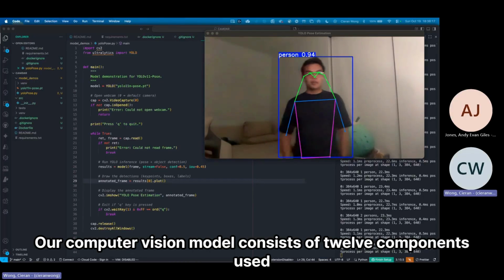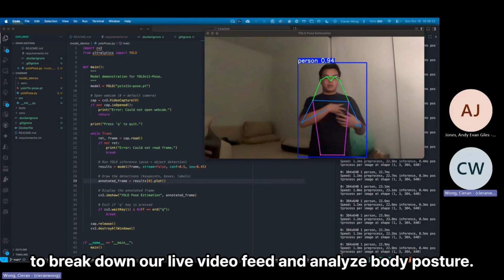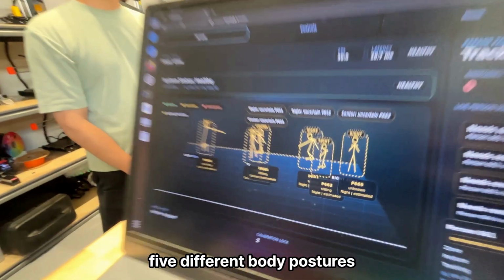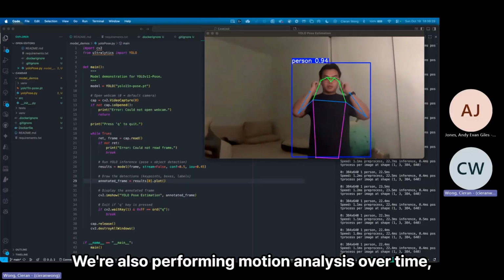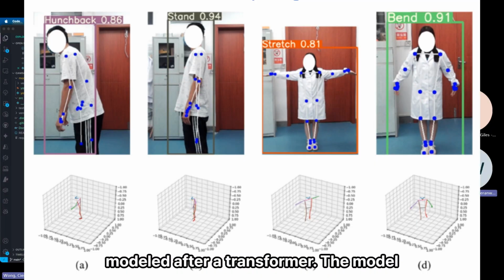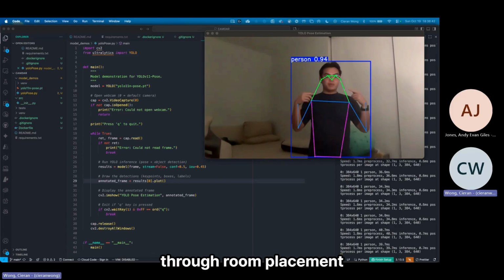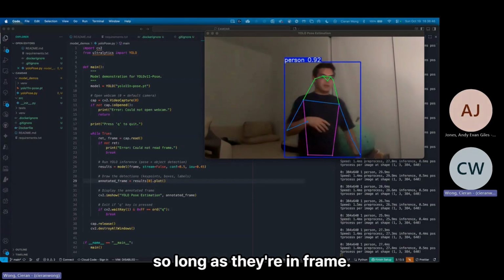Our computer vision model consists of 12 components used to break down our live video feed and analyze body posture. As of today, we're capable of analyzing 5 different body postures and 2 emergency states for heart attacks and choking. We're also performing motion analysis over time so we can differentiate whether someone has fallen down or decided to lie down for a quick nap. This is done through an algorithm modeled after a transformer. The model is capable of unique identification through room placement and allows us to keep track of the person's movement so long as they're in frame.